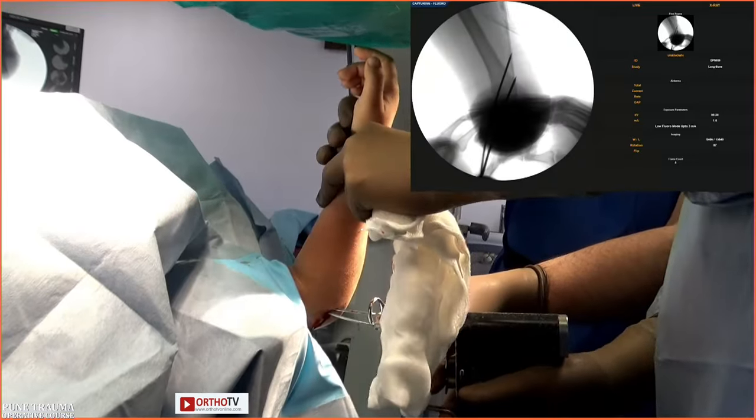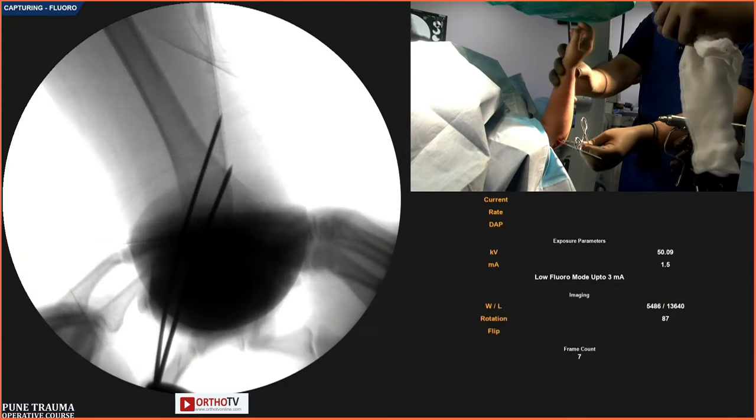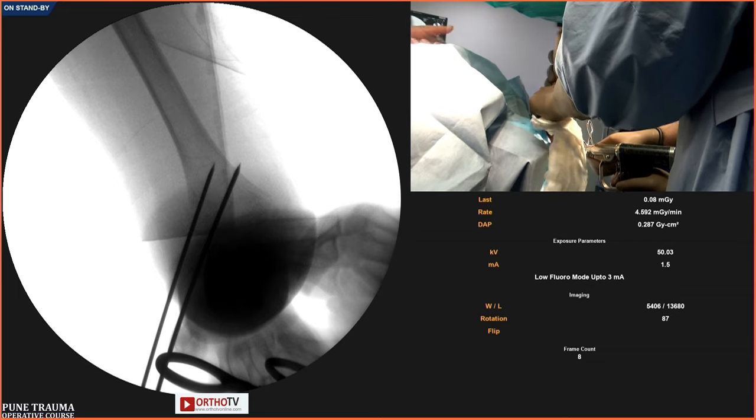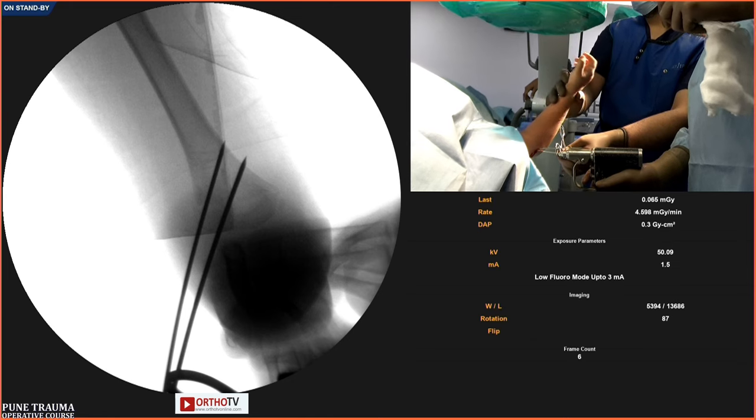Shoot. Okay, a little too much. Shoot. Right. Can you do it in extended position now? Yeah, since it's fixed. Shoot. Okay, so that is the pillar pin.